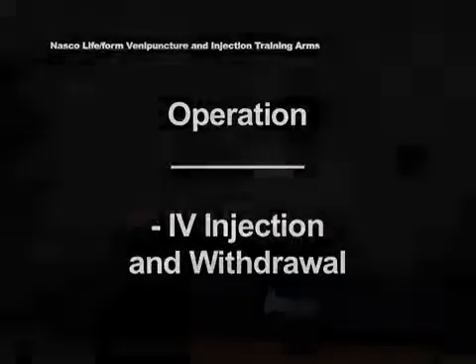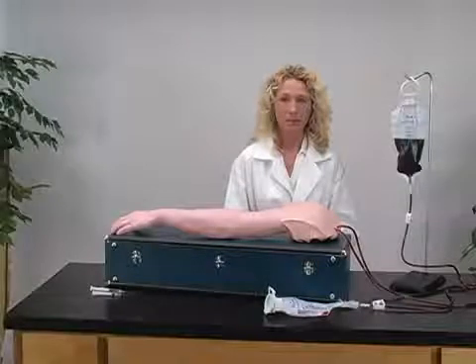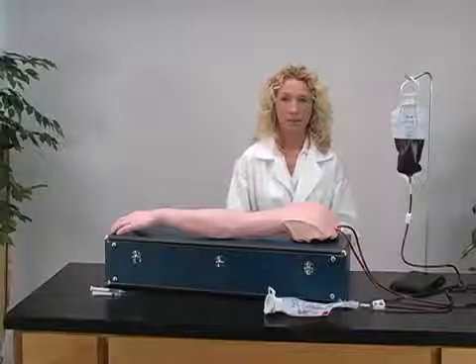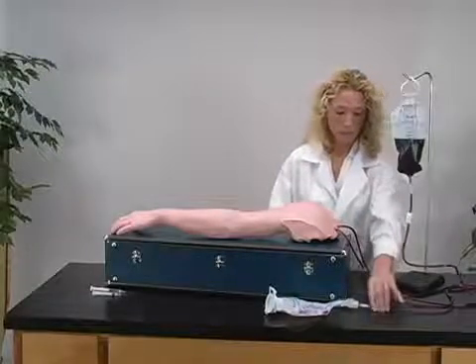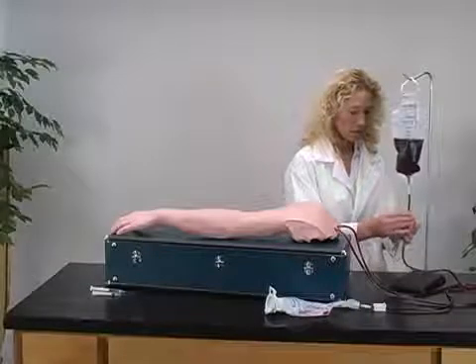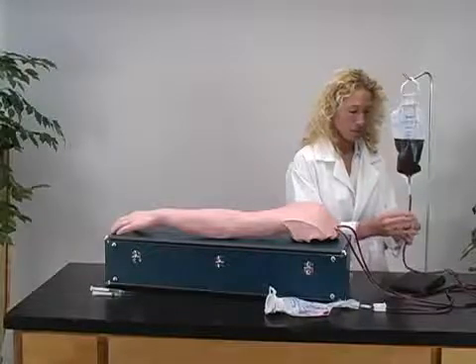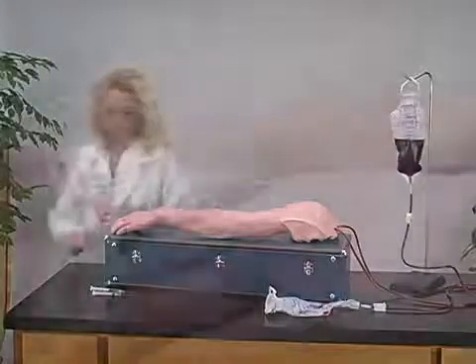For IV injection and withdrawal, begin again with a fully pressurized NASCO lifeform IV arm. First, close the clamp for the bottom IV bag, then open the clamp on the top IV bag. Your arm is now ready for injection or withdrawal along any vein on the arm.